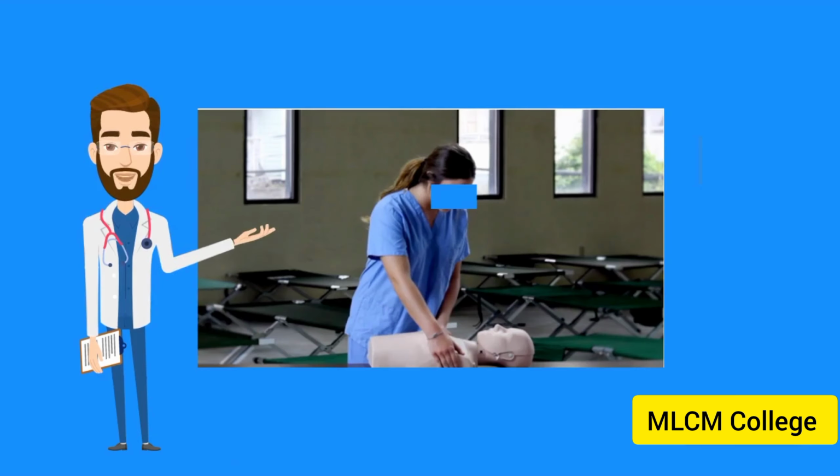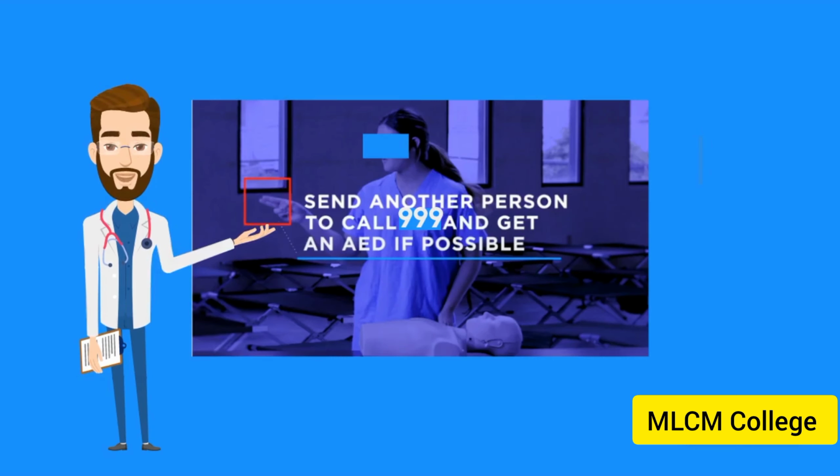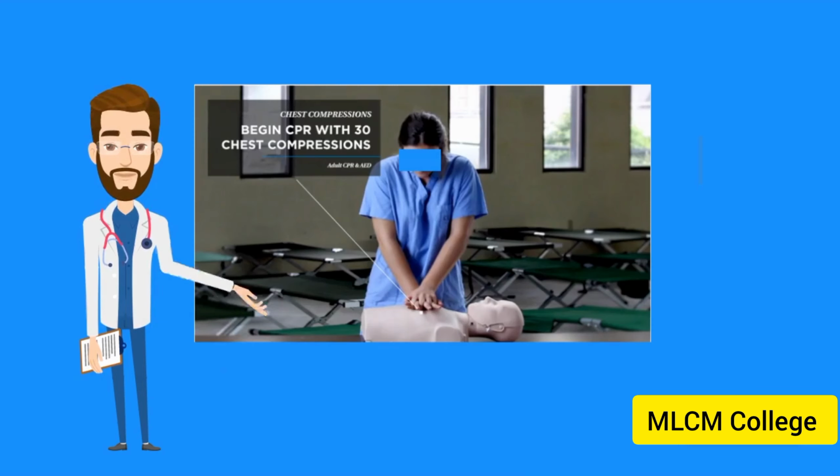If the scene is safe, approach the victim and assess their responsiveness. Send another person to call 999 and get an AED if possible. If the victim is not breathing or only gasping, begin CPR starting with compressions.